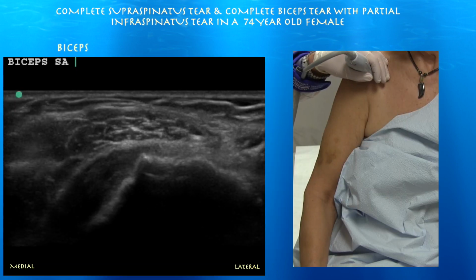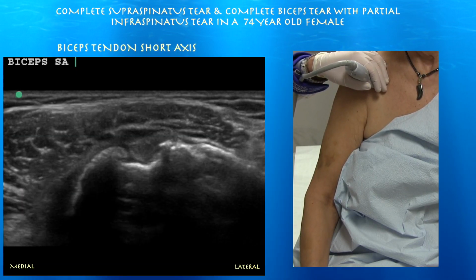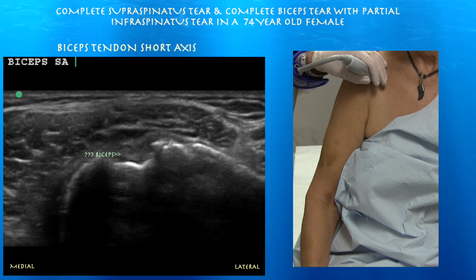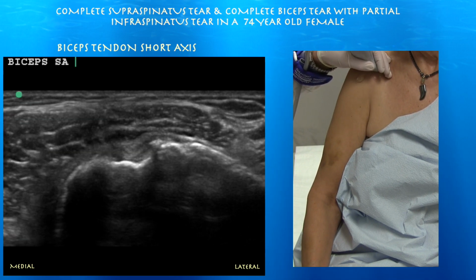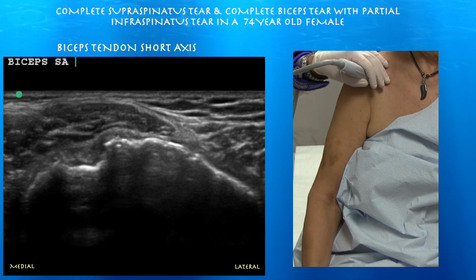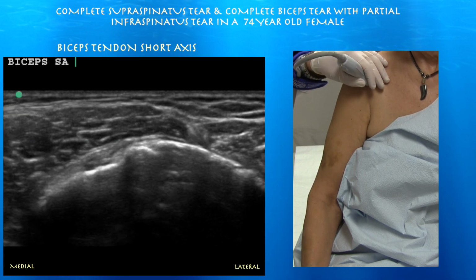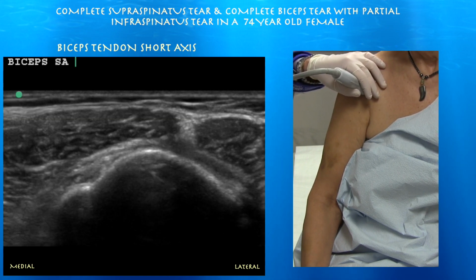Okay. Biceps tendon in short axis. Left side of the screen is medial. And actually may see a little residual biceps here. MRI did not show any biceps in the sulcus. And I believe we're not seeing one, just maybe some overlying ligaments that may have collapsed into that sulcus.